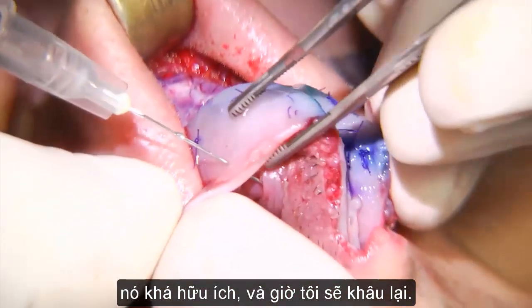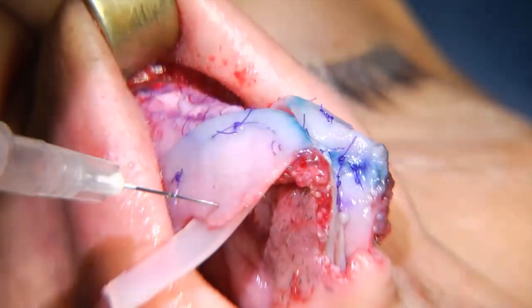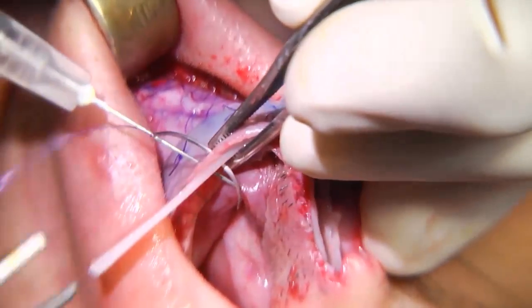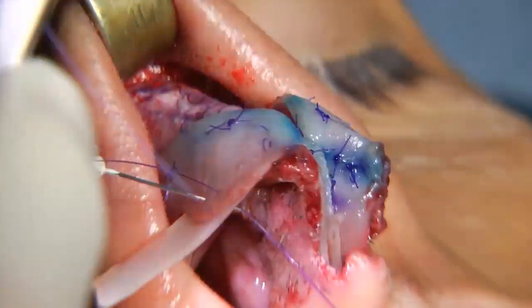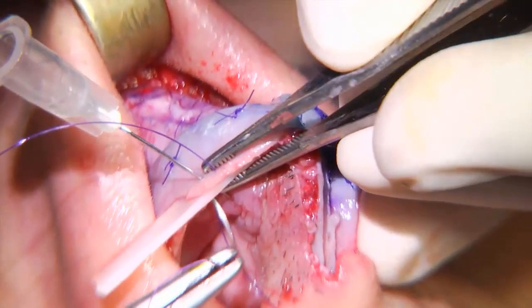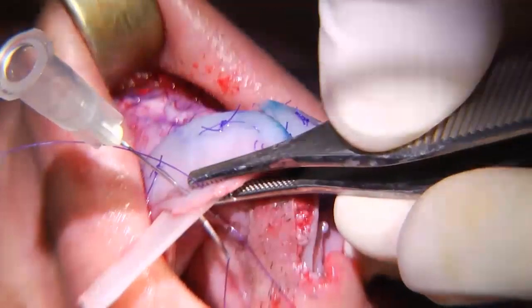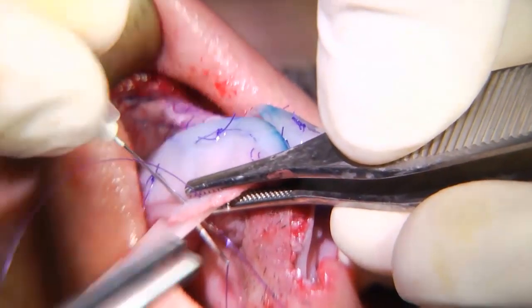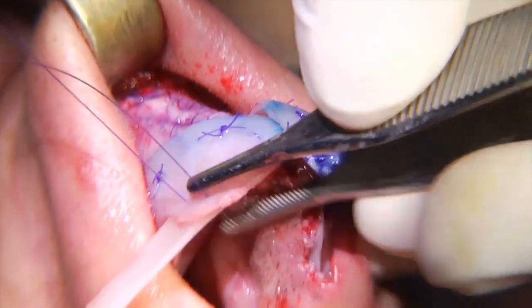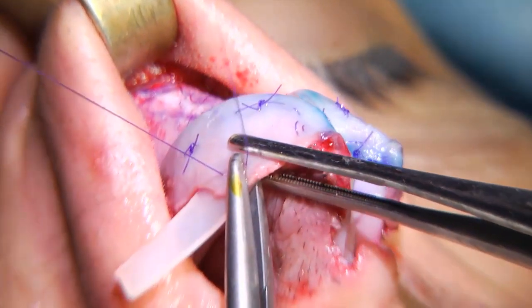5. Si vede bene? Belle immagini lei. Prendi il 6 per favore, Antonio, è pericolosamente grosso. 6. È veramente grosso. Tiralo via. E va bene. Bene, via. Guarda che non vada, che non shifti, che non giri. Ce l'ho. 6.